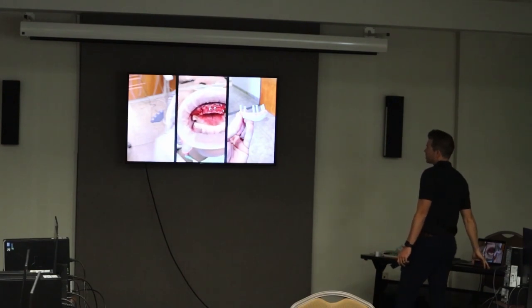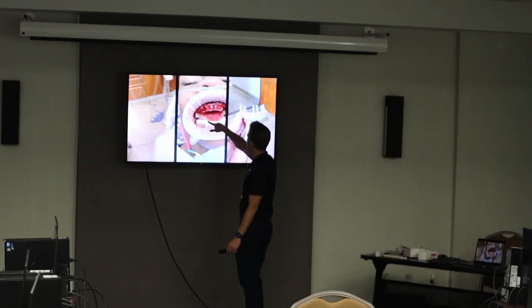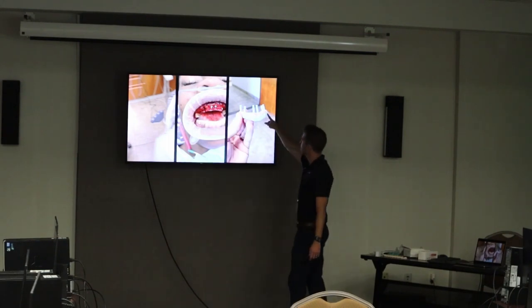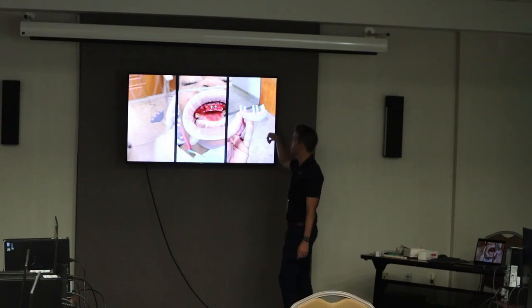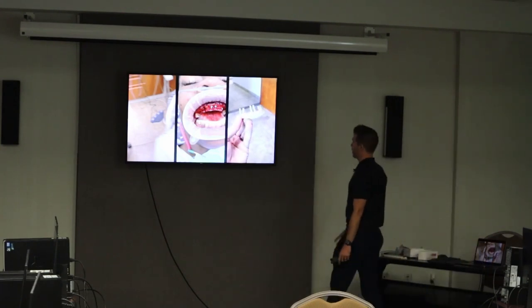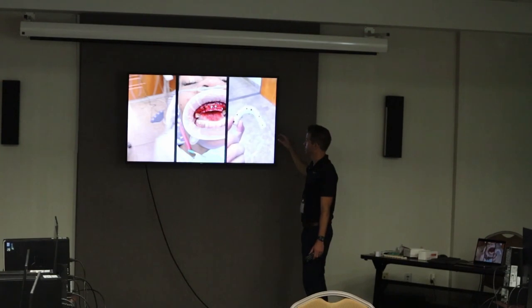The second molars are still in there — I pulled the canines and put all the multi-units on. Here's the first temporary that I had pre-printed, with just a quick pink paint on there. We did the pickup, then I put six multi-unit analogs on there and scanned it in our box scanner so we have records of the positioning.